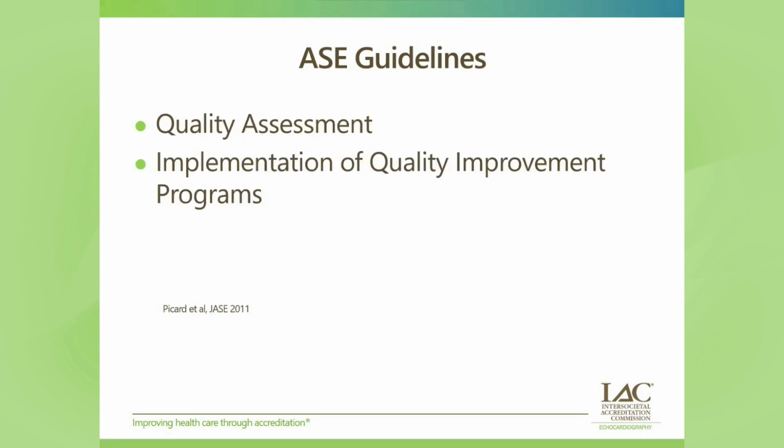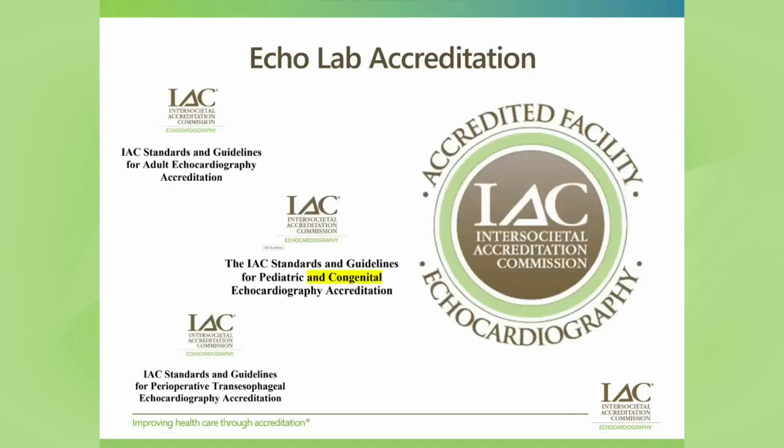ASE then goes on to make recommendations for quality assessment and implementation of a quality improvement program, where quarterly assessments are done to evaluate the quality of image acquisition, image interpretation, and results communication. And finally, the ASE also recommends that Echo Labs should be accredited by the Intersocietal Accreditation Commission, or the IAC. By doing so, a facility is provided with the framework to adhere to established standards in echocardiography, as well as the tools to implement a continuous quality improvement program.